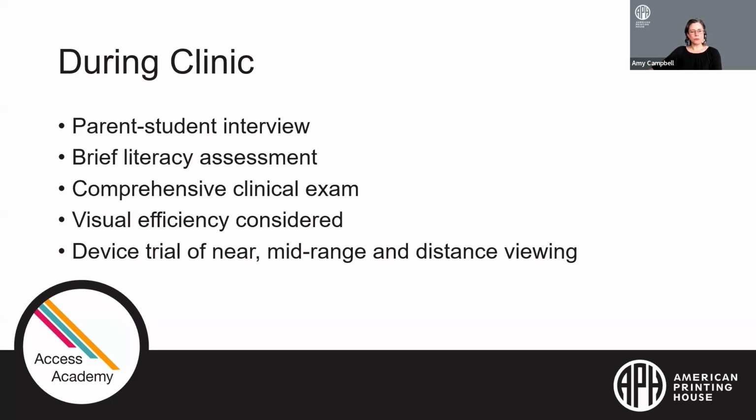Those are all things that we've also covered throughout this webinar series. The time then ends with an opportunity to try out different optical devices. And so within this model, each student spends at least an hour with the low vision specialist, and if needed, more time with the Project PAVE teachers.